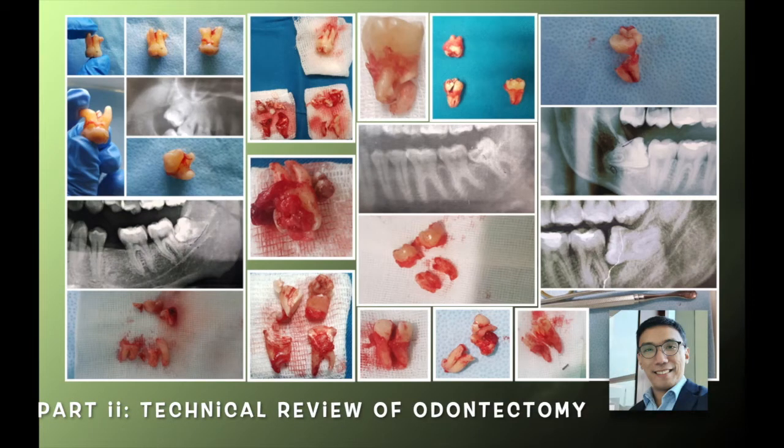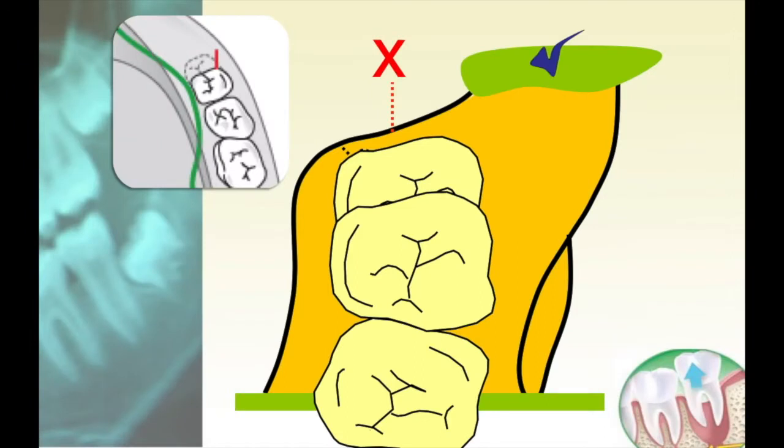Part 2. Technical review and the steps of mandibular third molar removal and the complications associated with it. In this technical review, we would look into key steps in the removal of mandibular third molar impactions.